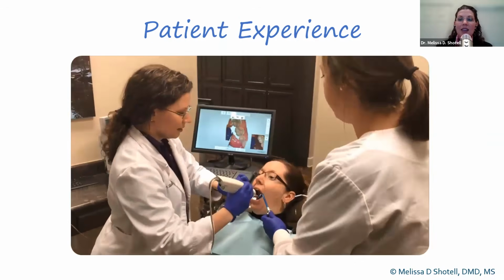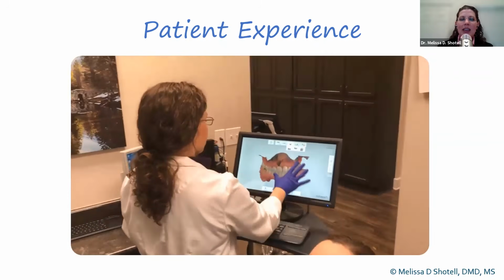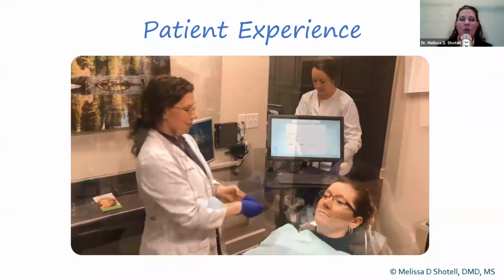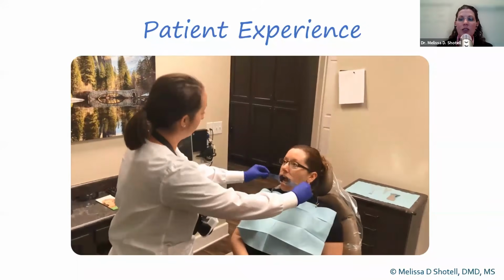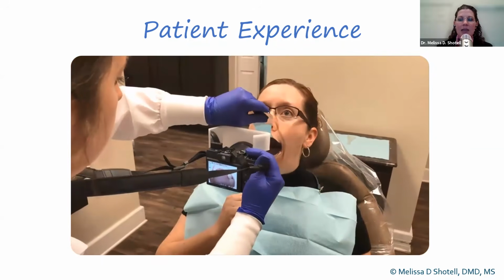This is something that I could easily delegate to my assistant. However, my patients expect to see me at every visit. So I like to take my intraoral scan, really checking to make sure that I have the qualities that I'm looking for when I'm setting up my patient's case in the software, capturing the 3 to 5 millimeters below the gingival margin with no missing areas or blebs in the scan.